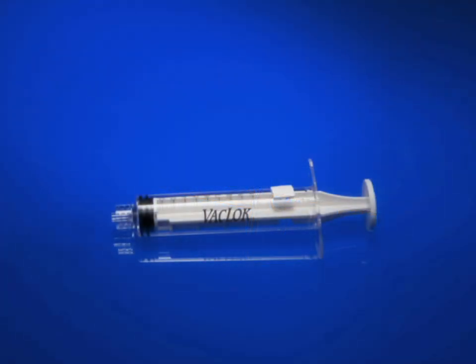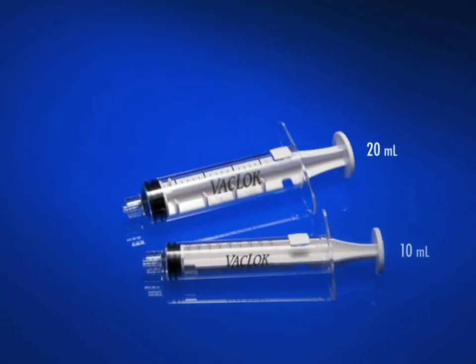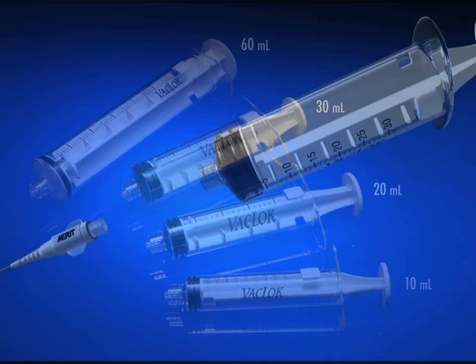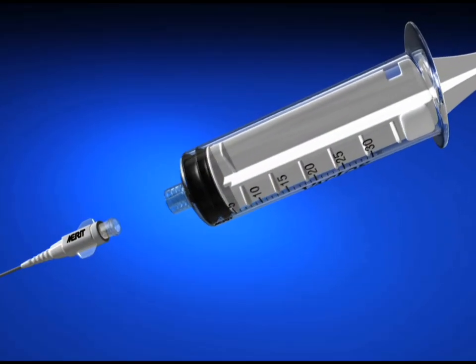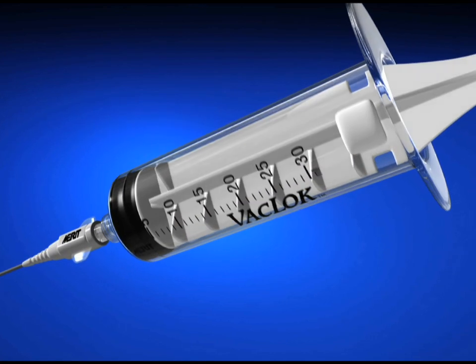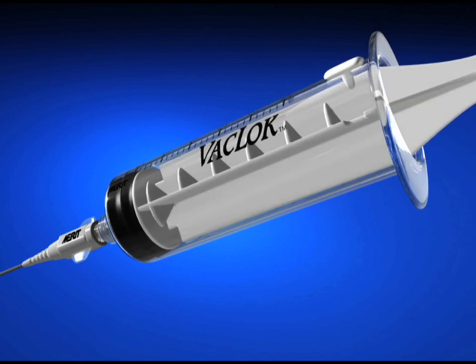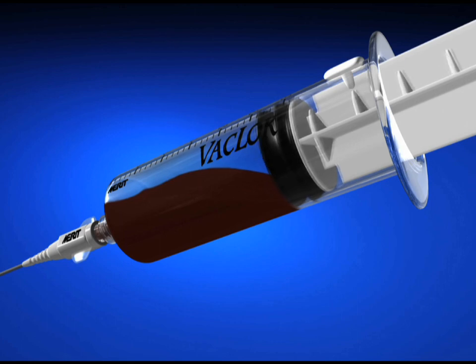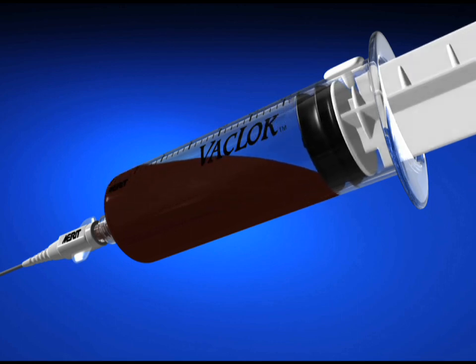The Vac Lock Syringe is available in a 10, 20, 30, and 60 milliliter size. To use the Vac Lock Syringe, first attach it to the desired device such as a stopcock, catheter, or tubing. Create a vacuum by withdrawing the plunger, then rotate and position one of the locking fins behind the stop pin in the barrel.